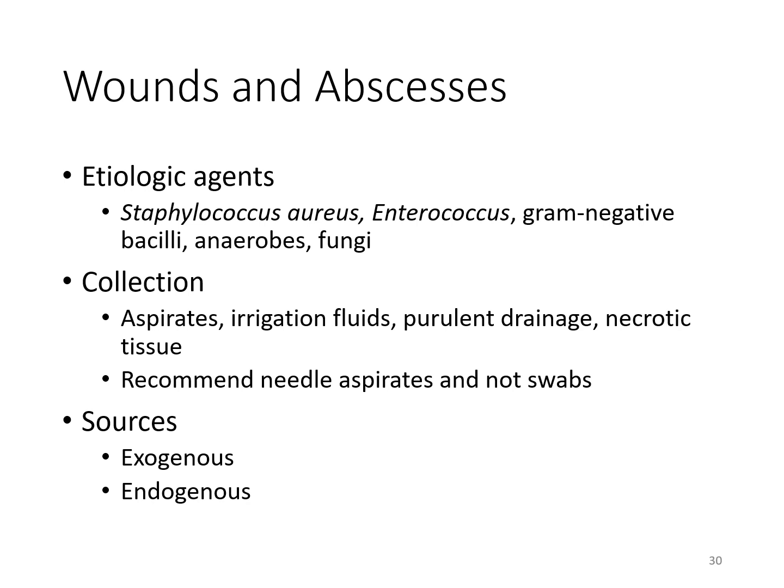It is recommended that for your aspirates you use a needle aspirate to maintain the viability of those anaerobic organisms, rather than using a swab. Occasionally you will have providers that submit an anaerobic culture on an anaerobic swab, and so you just risk the probability of those organisms not being viable once you set them up.